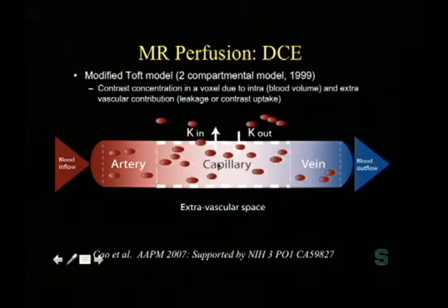So what happens with MR perfusion? MR diffusion is not using gadolinium. MR perfusion uses gadolinium. And when you're looking at these vessels, capillaries and other vessels have a normal membrane which provides the transmission of nutrients in which we live by, whether it's oxygen or other nutrients. You can now measure the ability of gadolinium or other blood particles to transfer out and transfer in. This equilibrium that's formed, or the rate of this transfer, is referred to as K-trans, or a transfer constant.